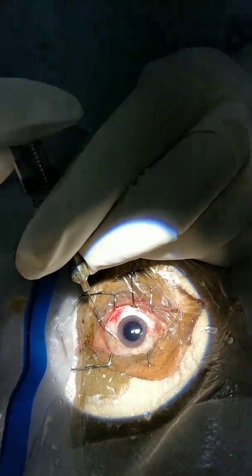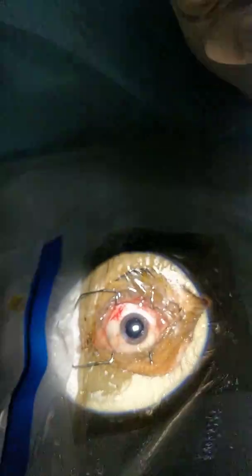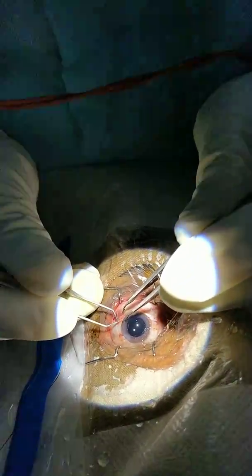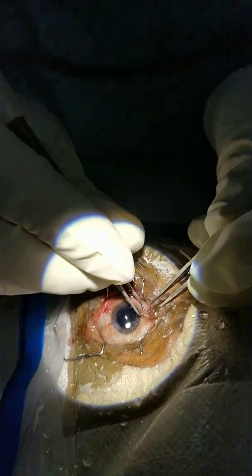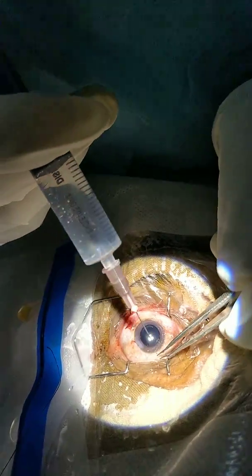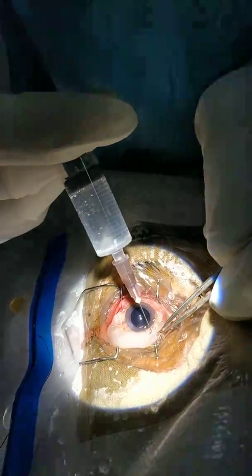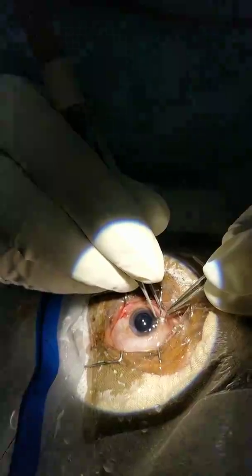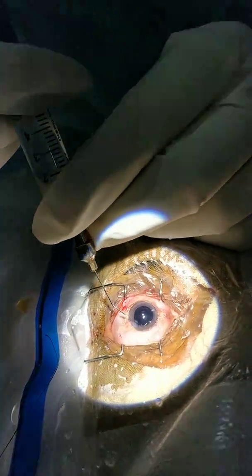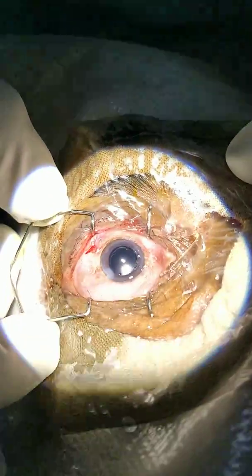So thus it completed my small incision cataract surgery. It took me around three minutes to complete. As I had cut the conjunctiva, I'll just seal it. I'm giving a subconjunctival injection — there will be swelling of the conjunctiva. A subconjunctival injection of antibiotic and steroid combination. Now I'll seal the side port. I'm just removing the speculum.